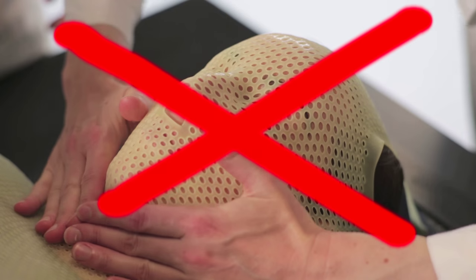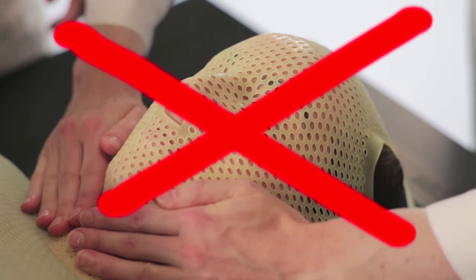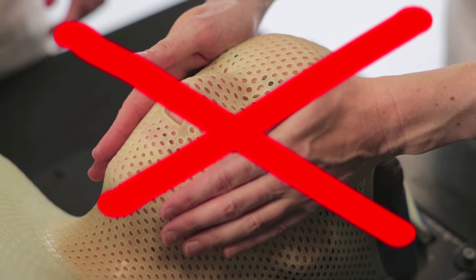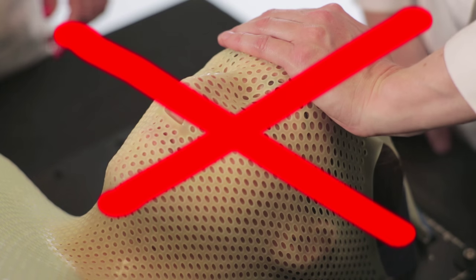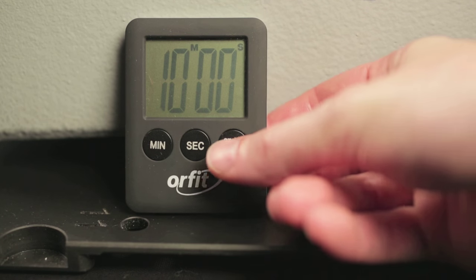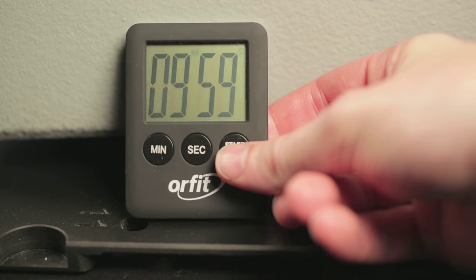Do not apply high pressure on the patient's throat to prevent discomfort. Do not mold over the forehead and the cheeks to prevent a mask that is too tight. Leave the mask to cool on the patient for at least 10 minutes.